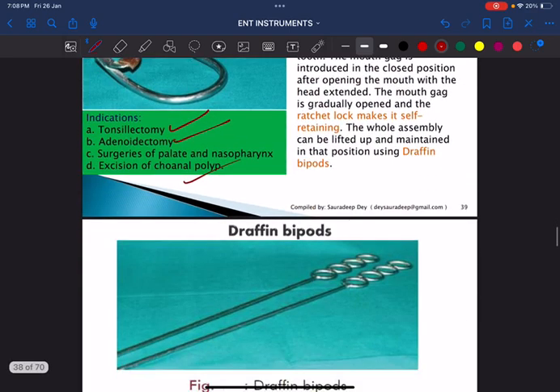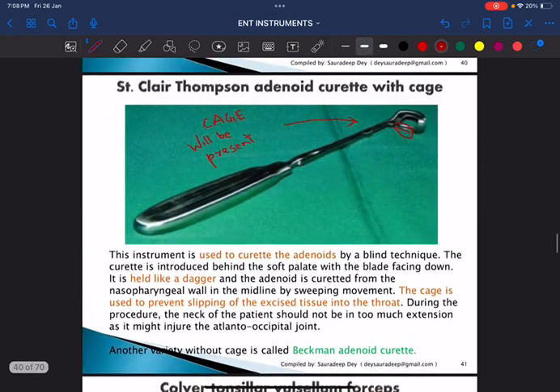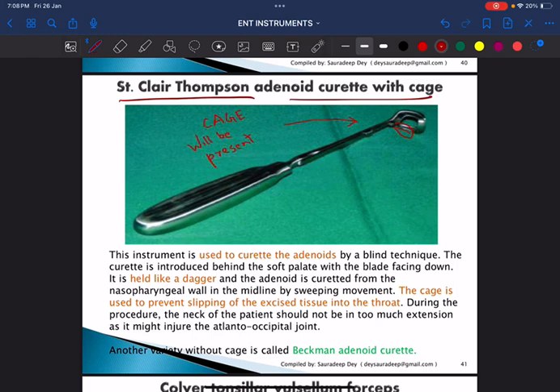This is the Sinclair Thompson adenoid curette with cage. There is a cage or basket at the end which holds the excised adenoid tissue. Note the distinction: the Sinclair Thompson mirror is used for posterior rhinoscopy, while the Sinclair Thompson adenoid curette with cage is used for adenoidectomy.